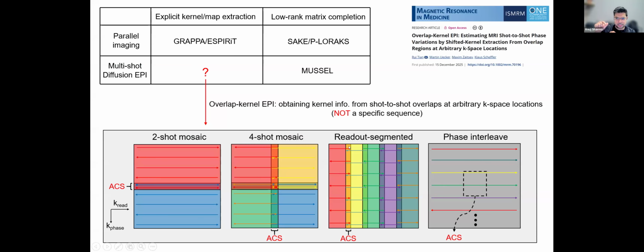Yeah, like the orange, the green, the purple, they are at different regions in k-space for your different virtual coils. No, because I think I drew it this way. Because there's overlap, if they completely overlap, you might not see it, so I shifted them a little bit. But they are actually at the same k-space location.